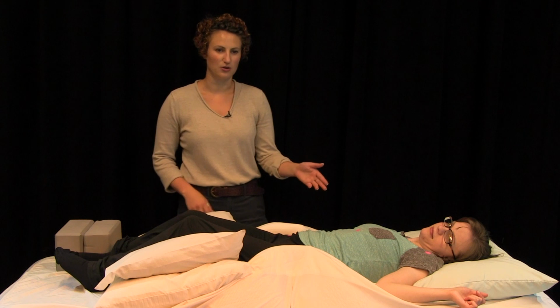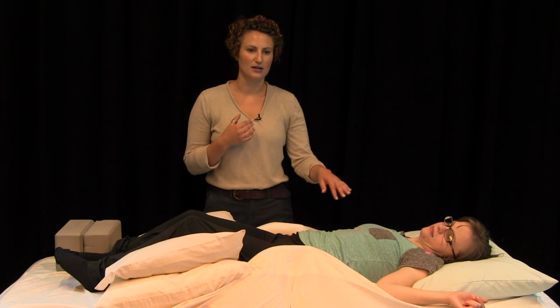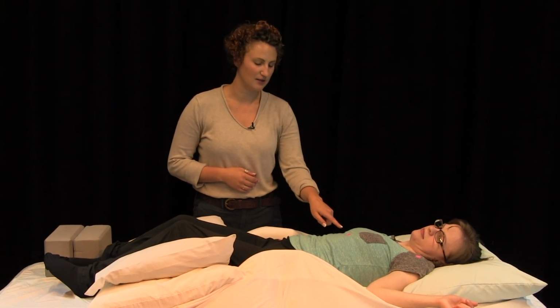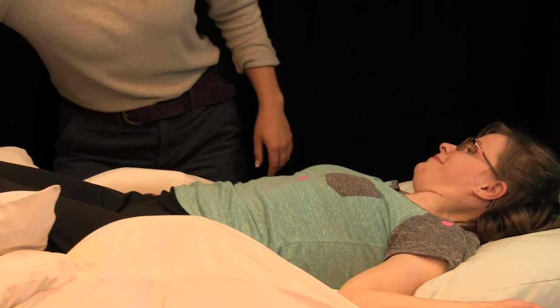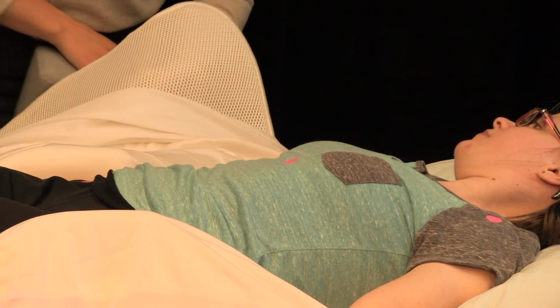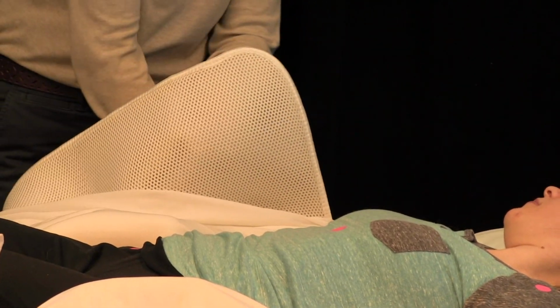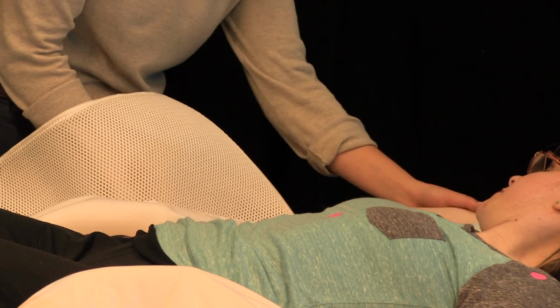Moving up the torso, observe the symmetry of the chest and spine. Notice whether or not the sternum is centered. To see this better, we have placed a marker on the base of Abby's sternum here. We will place the supports again between the two non-slip layers and get the supports that you've chosen nice and snug against the body. Do you mind if I move your arm up a little bit here? Nope, I don't mind.